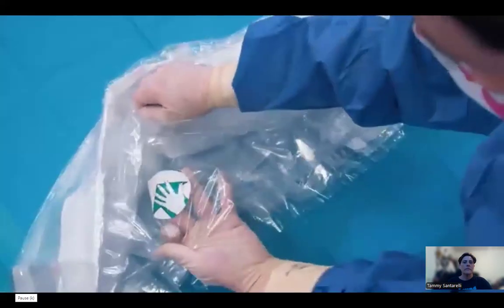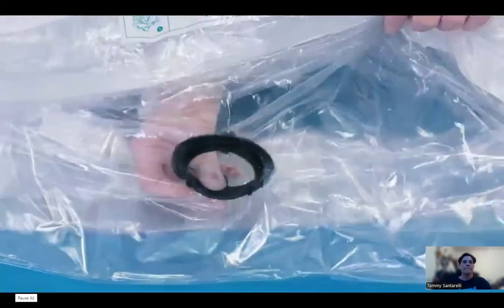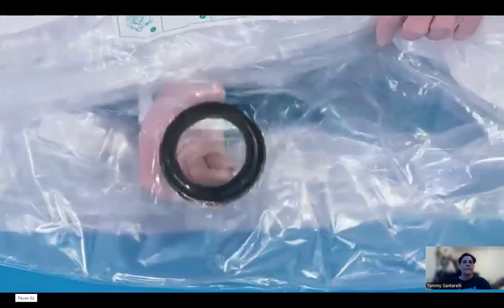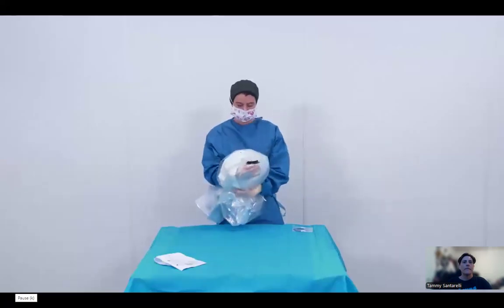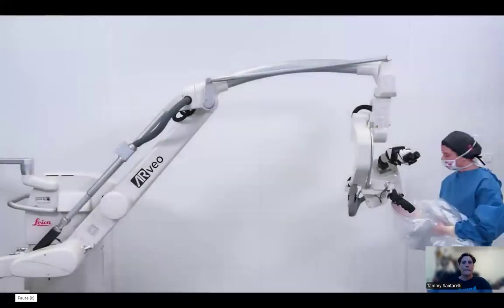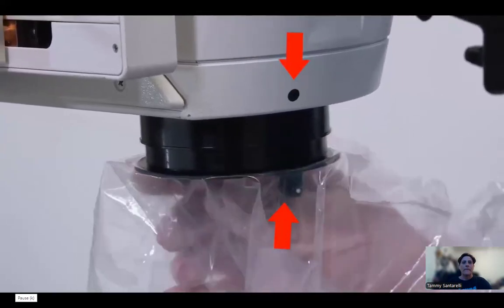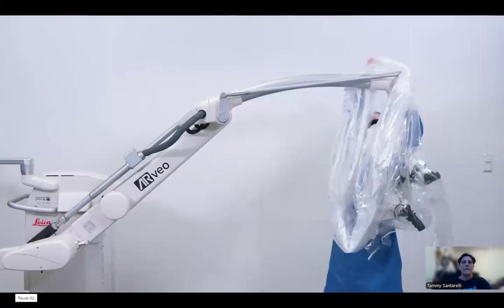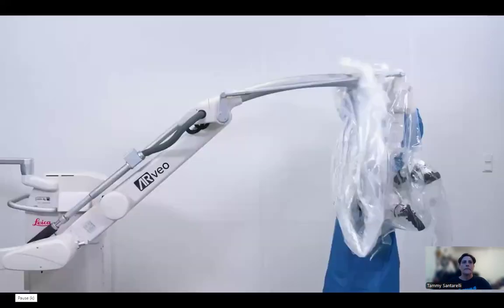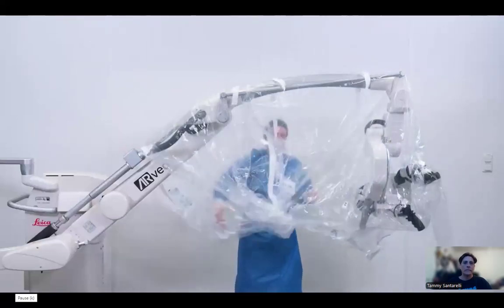Find the hand sticker and slide your hand inside the drape to find the lens cover. Hold the tab containing the white dot with your thumb, and the other tab with your index finger. Lift the lens cover at the same time as the remaining drape. Match the white dot on the lens cover with the black dot on the microscope, and twist to the right until you feel it is secure and locked into place. Move the drape over the microscope head and pull it over the rest of the arm. Your circulator can assist you, pulling the drape from inside over the microscope arm and wrapping the last band.